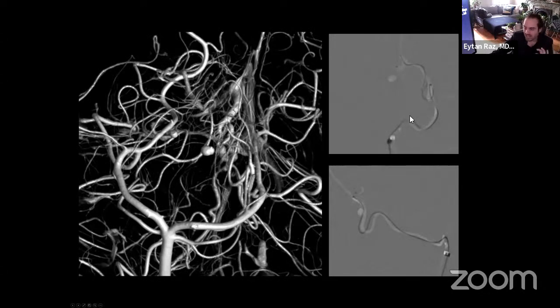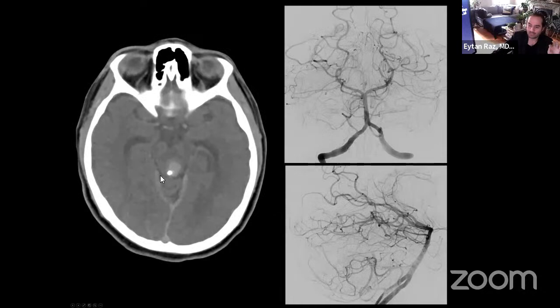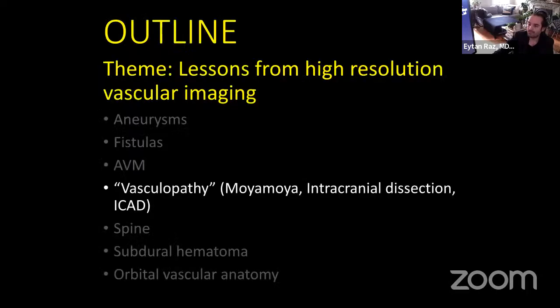You know what catheter to select, and then you get there and close this AVM with a little flow-related aneurysm. This is the post-glue embolization, selective injection, just closing the aneurysm, and certainly no aneurysm visible anymore. Will there be any residual AVM or not? We will ascertain that in a follow-up.